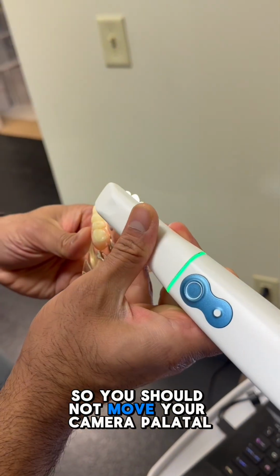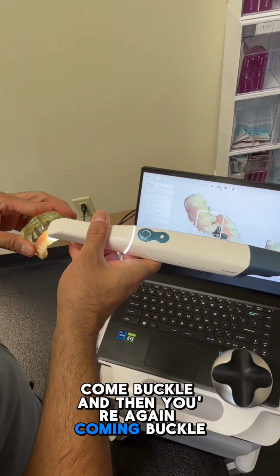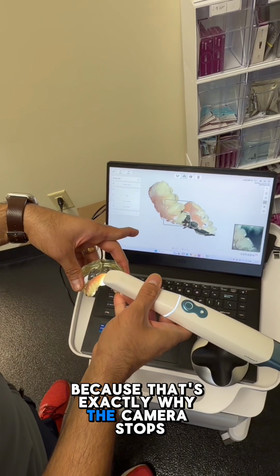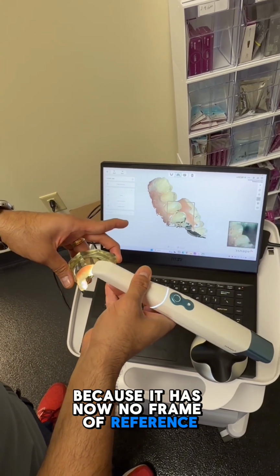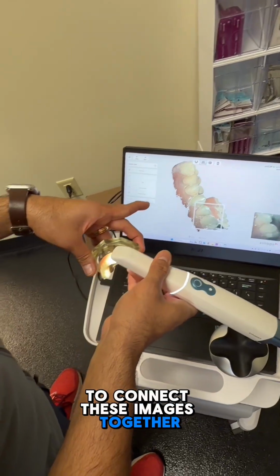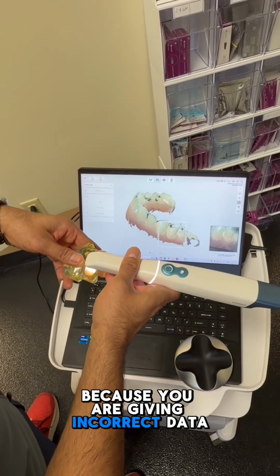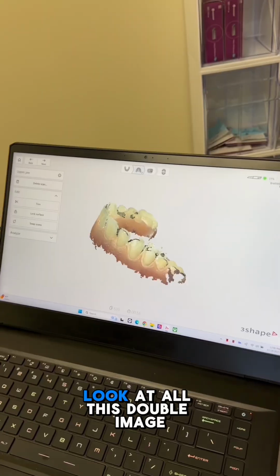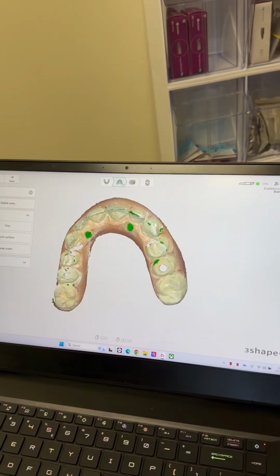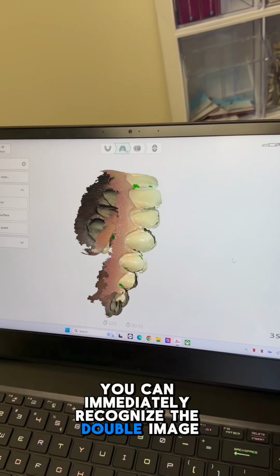So you should not move your camera palatal and then come buccal, because that's exactly why the camera stops: it now has no frame of reference to connect these images together. So the software is struggling because you are giving incorrect data, and this is where things get messed up. Look at all this double image. You can immediately recognize the double image.